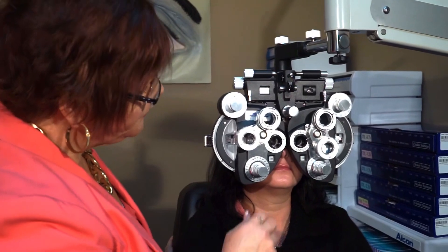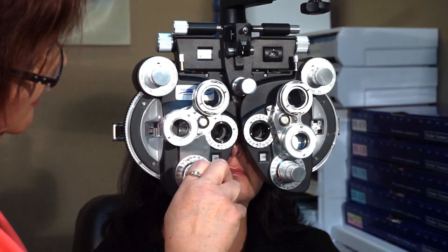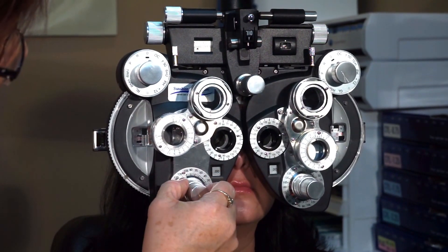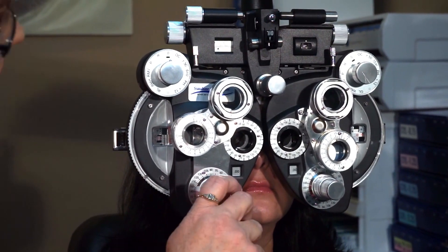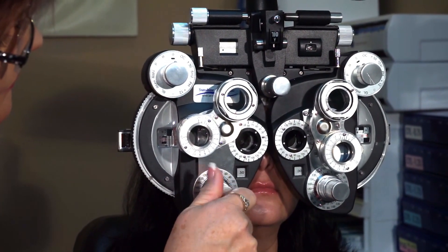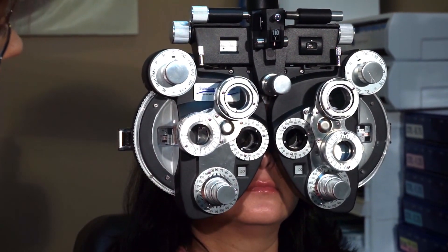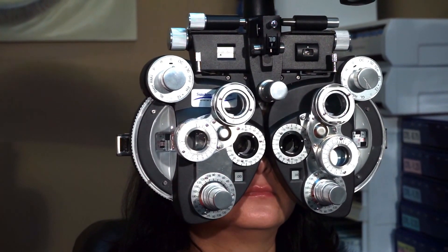I'm going to ask: do you want cylinder at axis 90 or not? If she has astigmatism somewhere around axis 90, she'll accept that cylinder and then we'll refine from there. If she rejects it, I'll offer her the next axis. Sharper and clearer, lens one or lens two? Two. So she doesn't want cylinder at axis 90. Let's go hunt at axis 45. Sharper with lens one or lens two? One. So she doesn't want cylinder at axis 45 either.